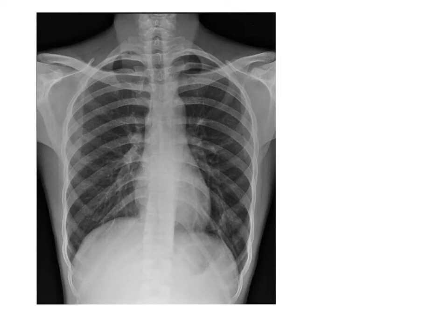Ribs can be very difficult for students as there are many variations and different protocols at different clinic sites on how to go about doing these. For our purposes, we are going to use our textbook instructions and goals and what we've been going over in class. What you're looking at right here is a PA projection of above diaphragm ribs.